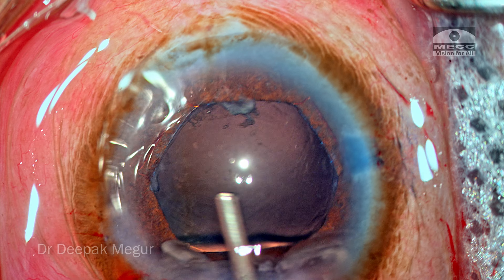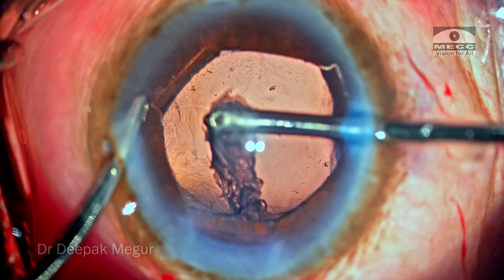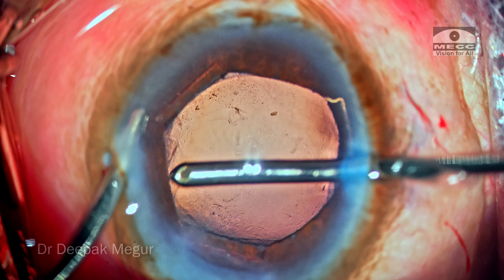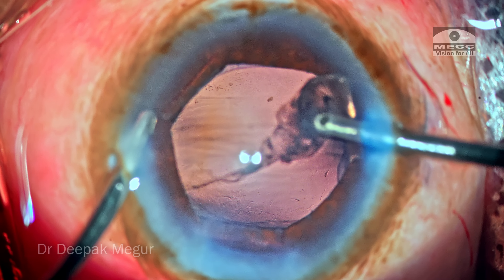So far so good. Time to aspirate the cortex. Some of the cortical fibers are quite sticky and sticking onto the posterior capsule, taking a little bit of time, but I'm still not finding anything unusual. The bag seems to be holding on well. There's no evidence of zonular dehiscence as of now.